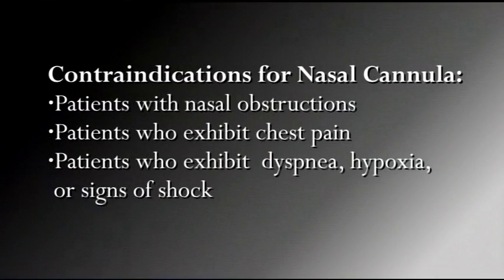Obviously, it is contraindicated for patients with nasal obstructions. A nasal cannula also should not be used with patients who exhibit chest pain, dyspnea, hypoxia, or signs of shock.